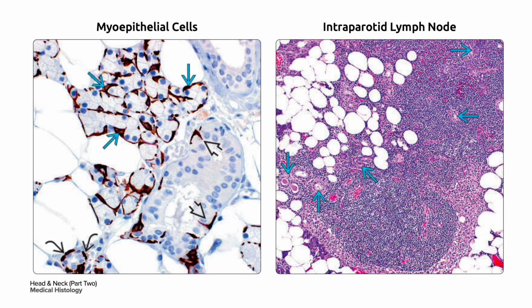On your left are the contractile myoepithelial cells, which are difficult to discern on H&E but can be appreciated using immunohistochemistry with calponin. They are located around the acini in the single blue arrow, around intercalated ducts in the curved black arrow, and focally in some proximal striated ducts in the bold black arrow.